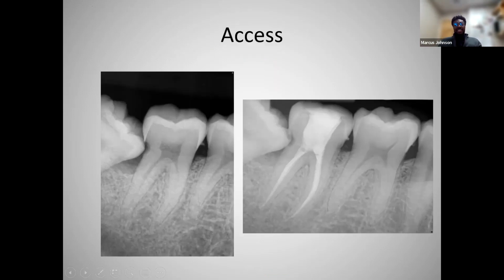So this was a more traditional access that I used to do. Little void there, excuse the blind spot. But this is a good example of that kind of funneling technique and gouging. So nowadays, I would want to respect more of this tooth material here, this dentin, and keep more of that intact. Set my point of negotiation from this mesial pulp horn down, and then from the distal, just like that, to have a more conservative access, preserving more of the pericervical region, or the region which we deem as highly valuable when we're talking about the hierarchy of tooth needs.